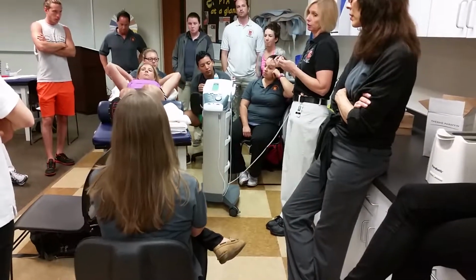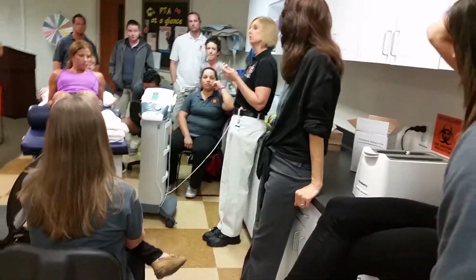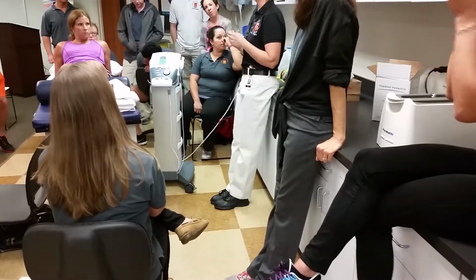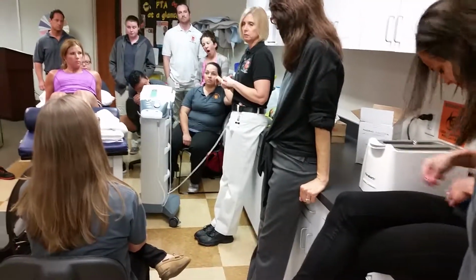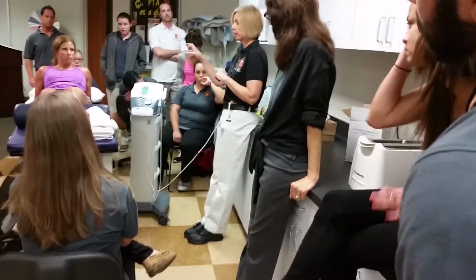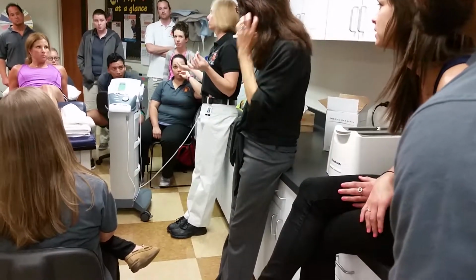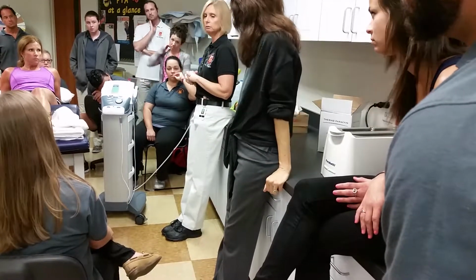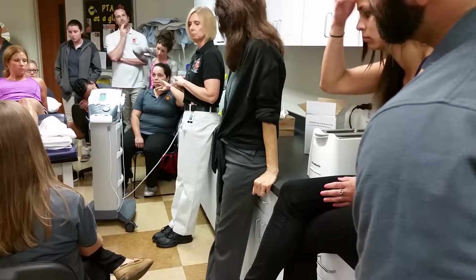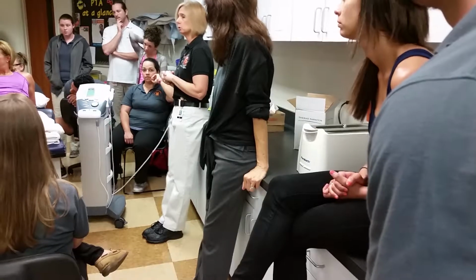All right, so that's application. If I decided I wanted pulsed instead, the setup would be essentially the same, except I would put the duty cycle that I wanted. If she was very inflamed, I would do 20%. And now, what do I turn it up to? Because she can't feel it, 0.8. I don't need to go any higher. Research says 0.8 is effective. So the only time you would turn it up is when you're doing thermal. That's the only reason you would turn it up.